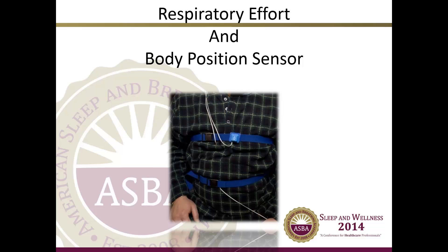Respiratory effort and body position are measured by two respiratory belts — one around the thorax and one around the abdomen. The body position sensor is generally placed on the thorax or upper belt. The belts are generally made of elastic material and are usually comfortable for the patient to wear even if pulled tight. The belt should be tight enough to achieve optimal readings based on subtle thorax and abdominal movements, but not too tight to restrict breathing. When applying the belts, it is important they do not get twisted, as this can limit the belt's ability to monitor subtle changes in effort.